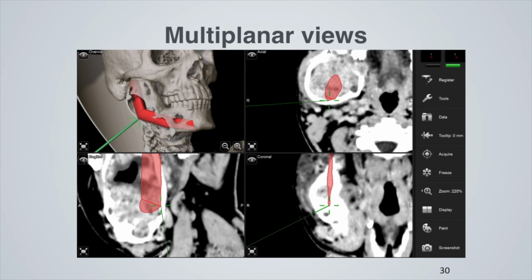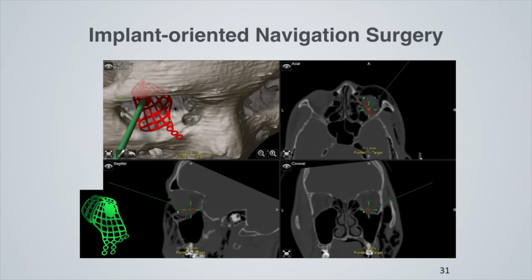And at that time, as a human being, you are going to be affected by your physiological barrier. You get tired, you get fatigued, and sometimes you get angry. The computer will tell us where to place the bone in the surgery. And this is another view to show we can have views in all directions. And it is a dynamic process where you can always adjust the positions according to your plan.